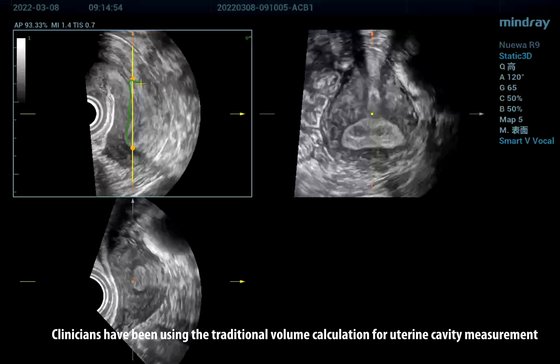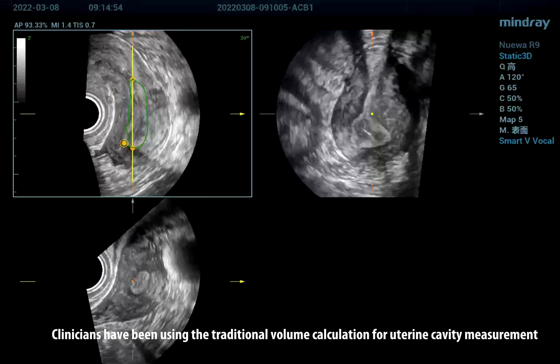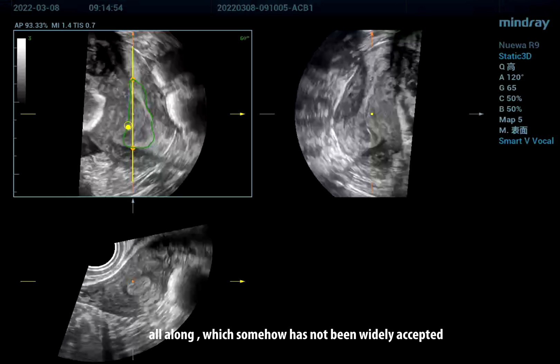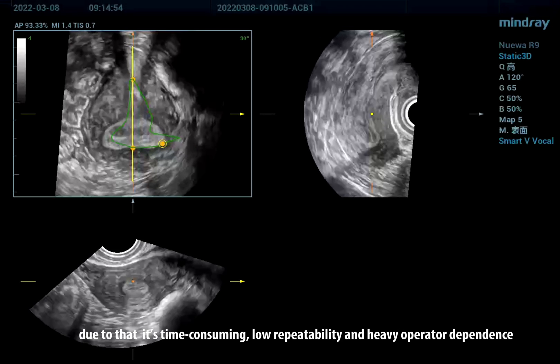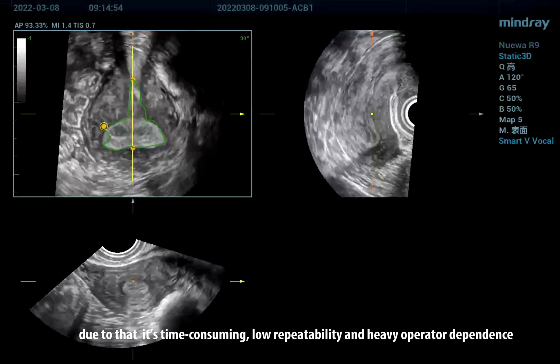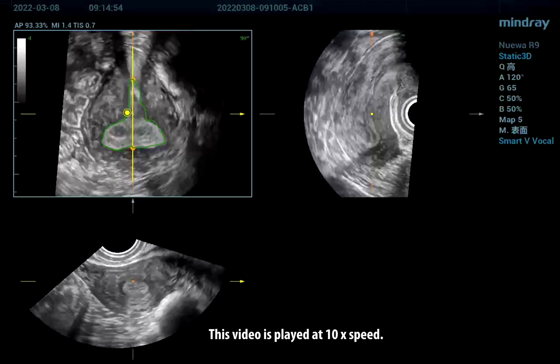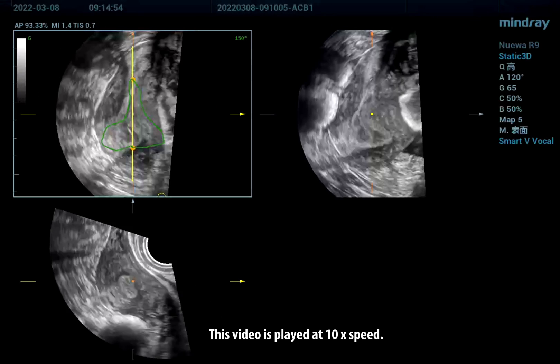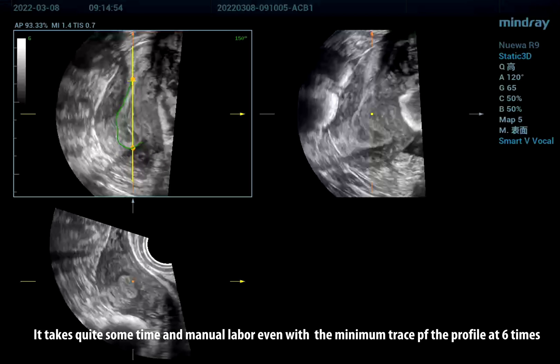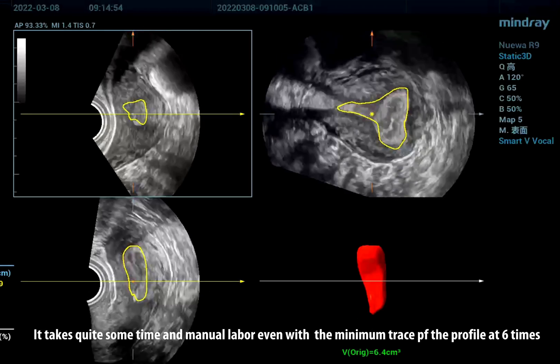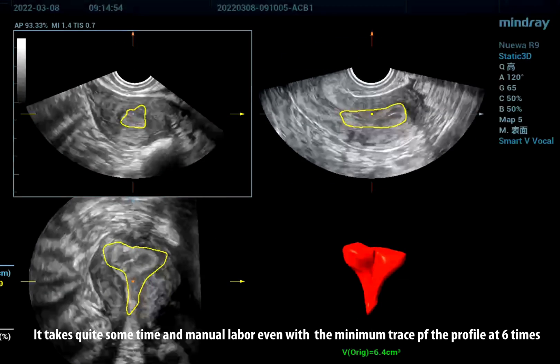Clinicians have been using the traditional volume calculation for uterine cavity measurement all along, which somehow has not been widely accepted due to it being time-consuming, low repeatability and heavy operator dependence. This video is played at 10x speed. It takes quite some time and manual labor, even with the minimum trace of the profile at 6 times.